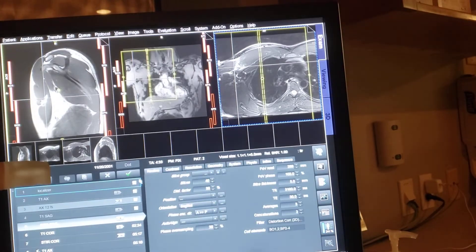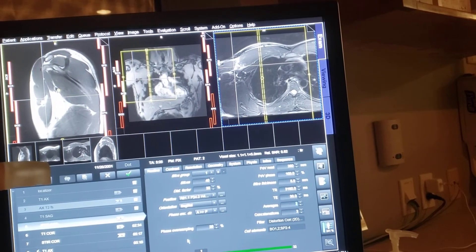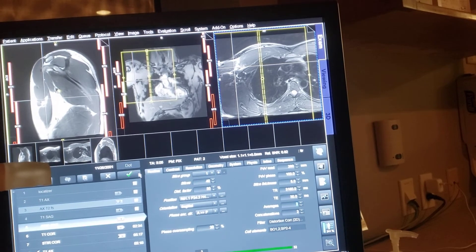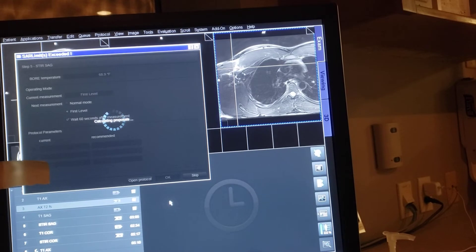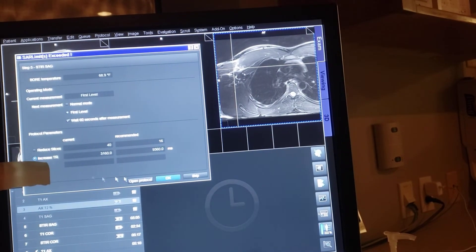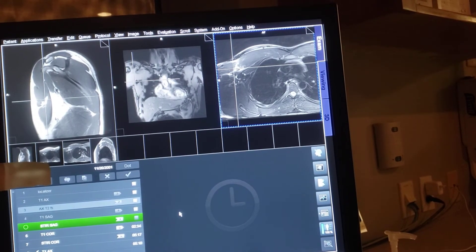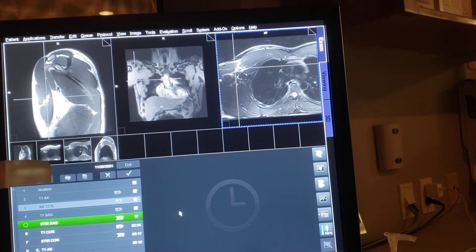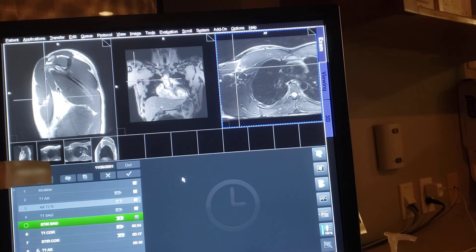I'm going to go way too high, so I'm going to drop my coverage here and then I'll be able to let it go. Now I can go down. But technically, this is how you set up for pectoralis — that's all to it.